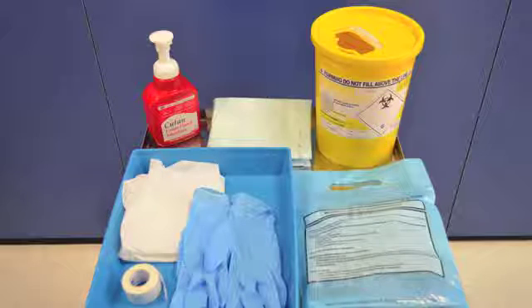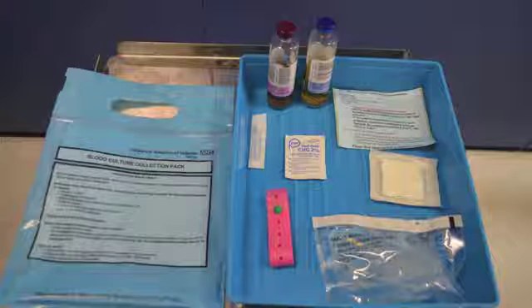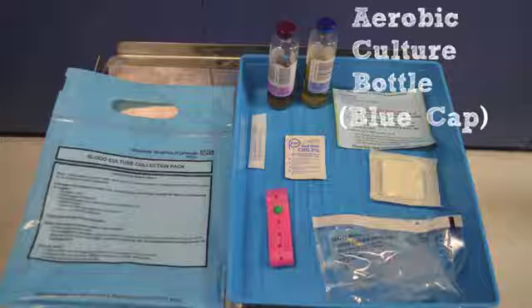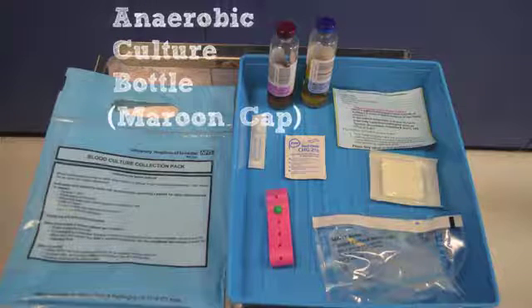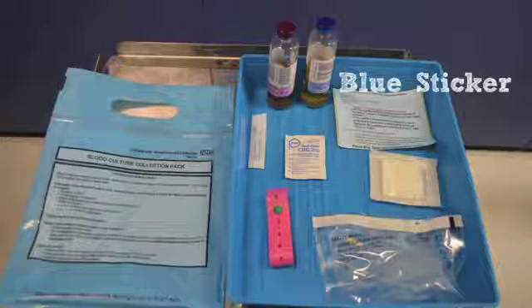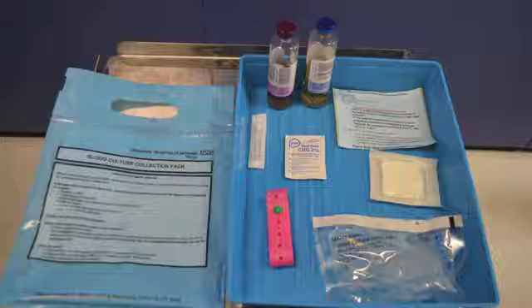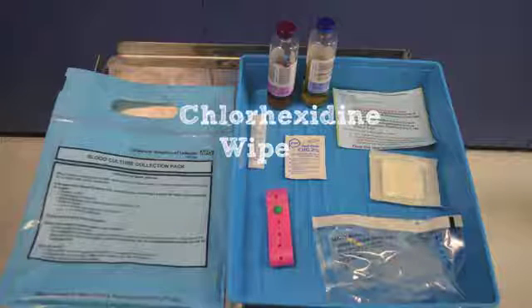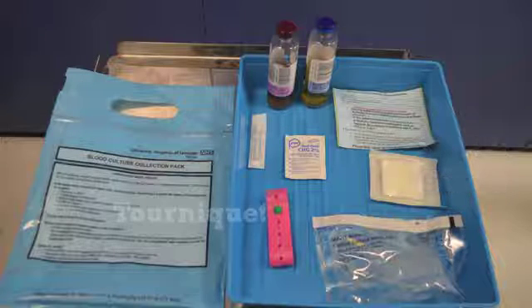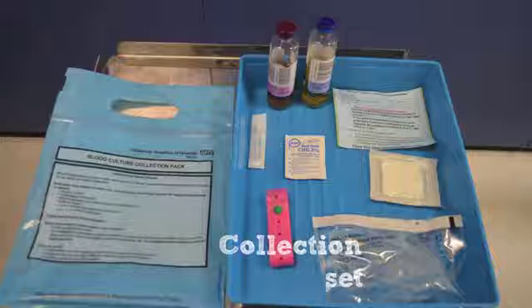Tape, blue blood culture collection pack. The contents of the blood culture collection pack consists of a blue capped aerobic culture bottle, a maroon capped anaerobic culture bottle, a blue sticker for documentation, ChloraPrep for decontaminating skin, chlorhexidine wipe for cleaning the blood culture bottles, sterile gauze, disposable tourniquet, and a collection set including the butterfly needle.